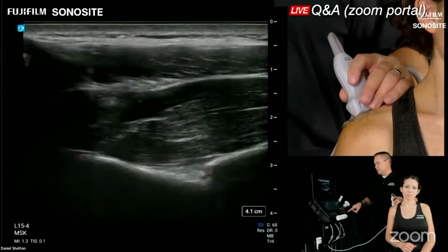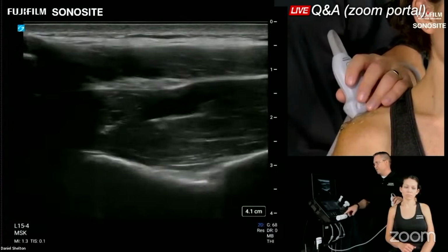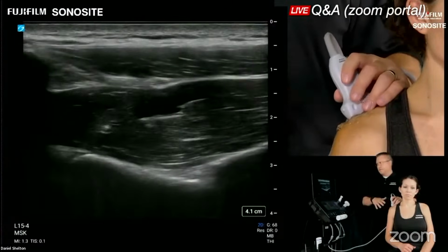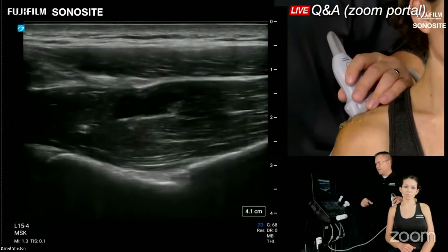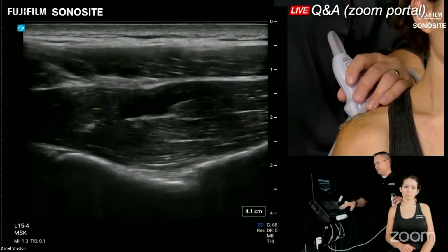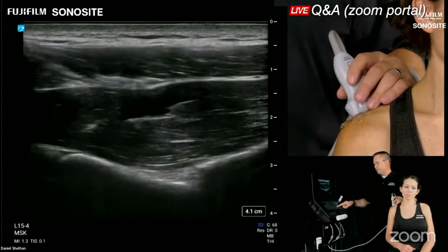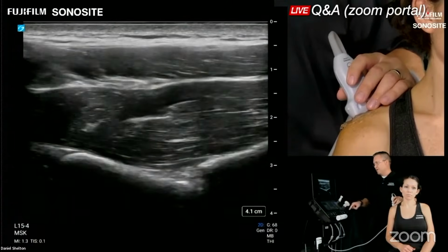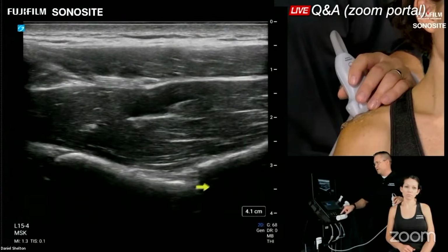If you're having a hard time seeing the bottom of your patient's supraspinatus fossa with good clarity, I advise you to drop your frequency for a linear array transducer going through a lot of trapezius and then through the rest of that depth on the neck. Sometimes you have to lower your frequency. So on the Sonosite PX under the MSK exam type, I'm going to select Gen mode, and you're going to see the bottom of the screen brighten up pretty good. There we go. And I think that clarifies that suprascapular notch a little bit better. So here's our notch.